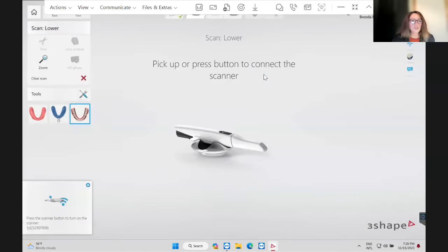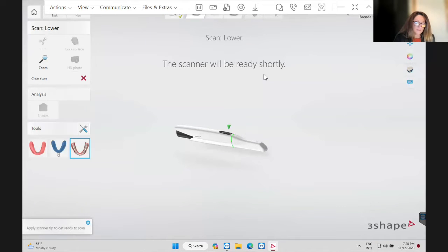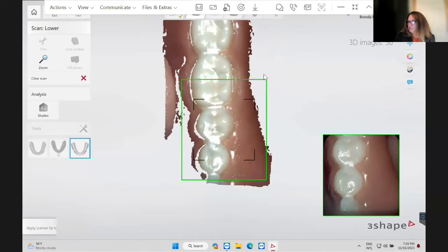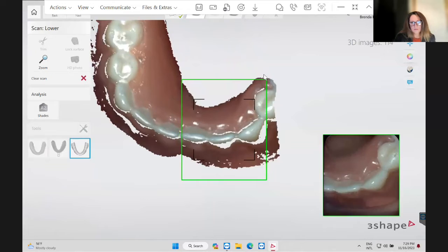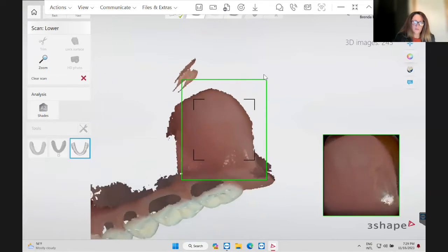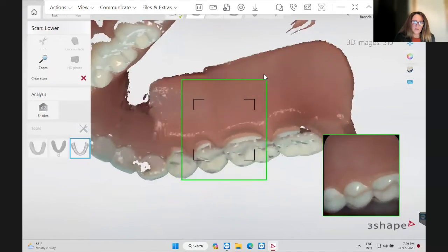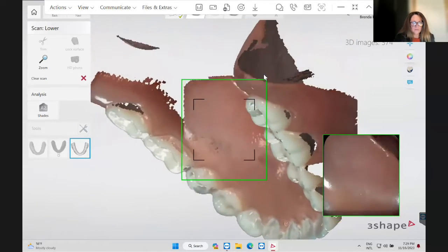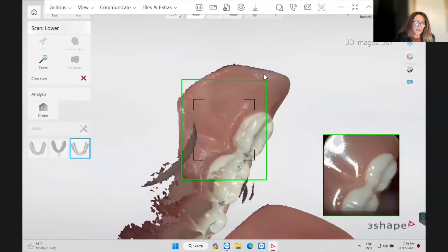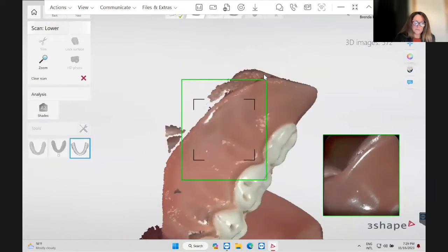And I can switch it either way if you want to see it live, or I could just, because I have my camera set up too. Then we're going to come around. And right now I'm holding the denture steady in my hand and I'm moving the scanner.